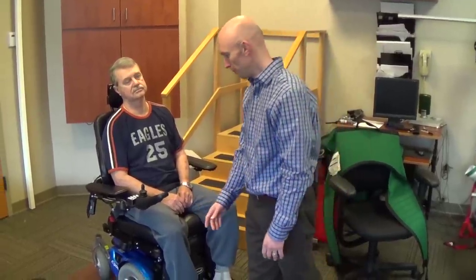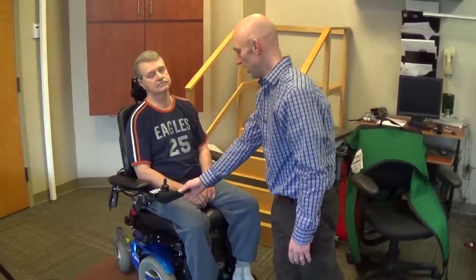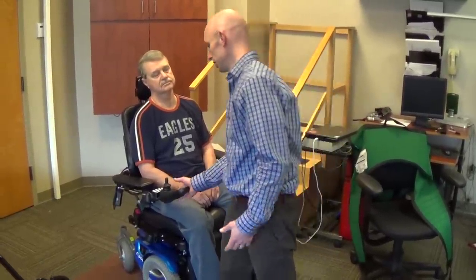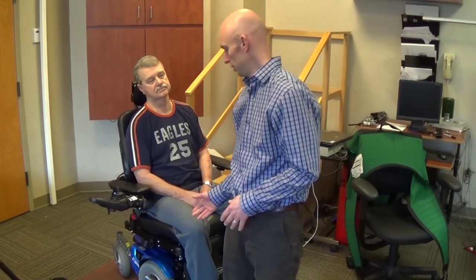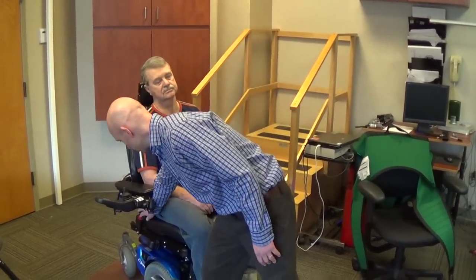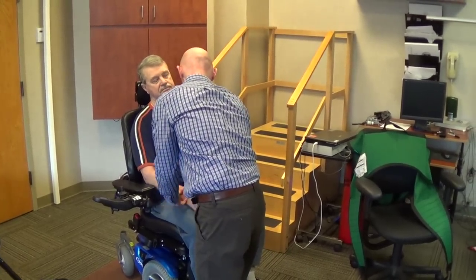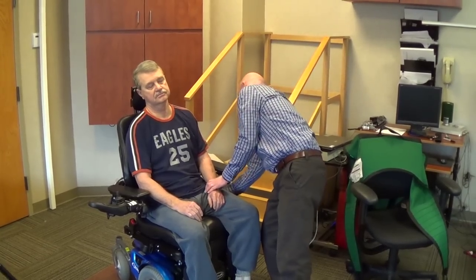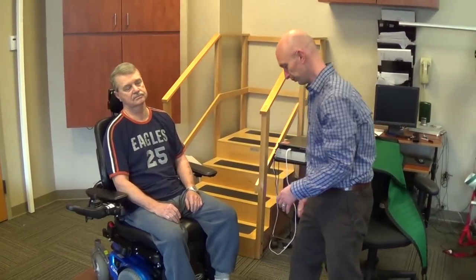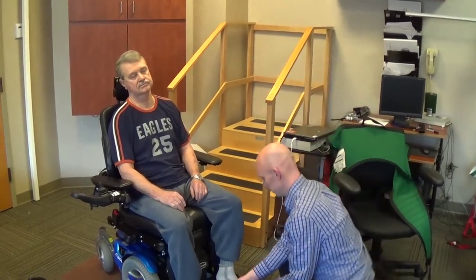First, if they're in a power wheelchair, you want to make sure the power wheelchair is off. And if it has a retractable joystick handle or swing away, moving it out of the way will just reduce risk of damage to the component. Also making sure the seat belt is unbuckled for the patient once they're securely in a position in the wheelchair. And also lifting the leg rest up.